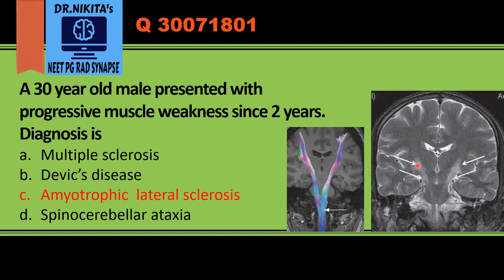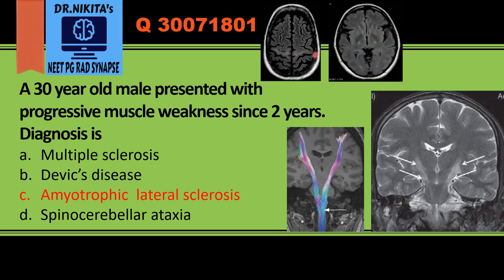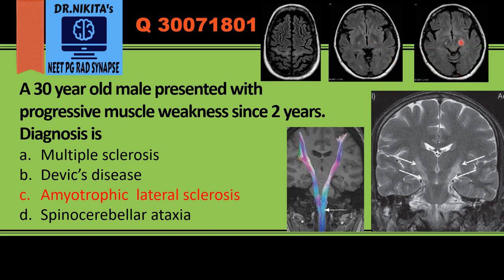This hyperintensity due to Wallerian degeneration from neuronal loss is seen in the entire corticospinal tracts, starting from the precentral gyrus going down the pyramidal tracts and into the spinal cord. In this image, we see bilateral symmetrical hyperintensity in the precentral gyrus (the motor strip), in the internal capsules, and in the cerebral peduncles. That is how ALS presents on MRI.